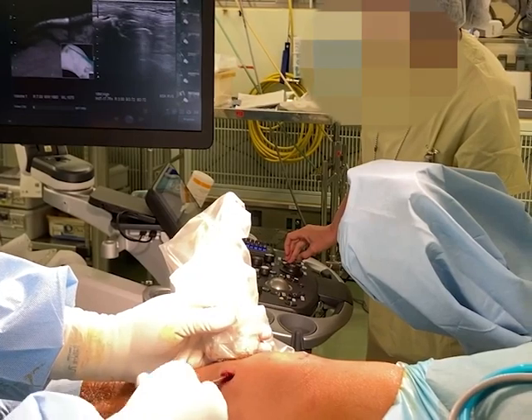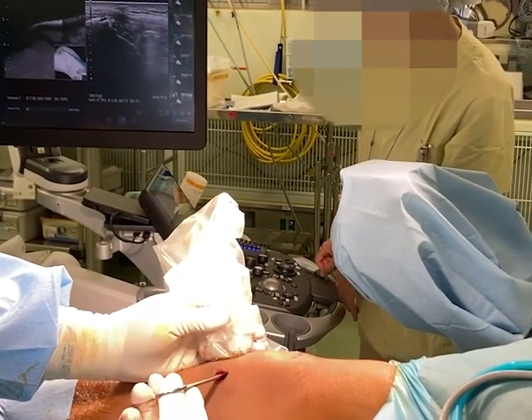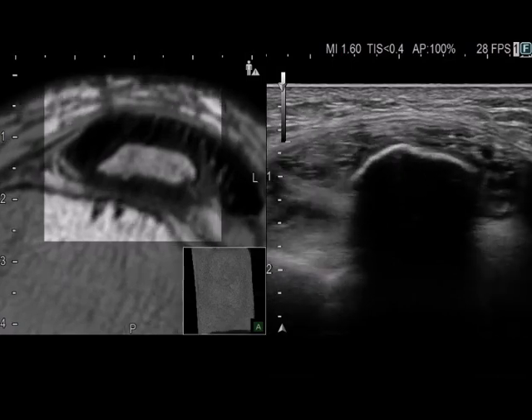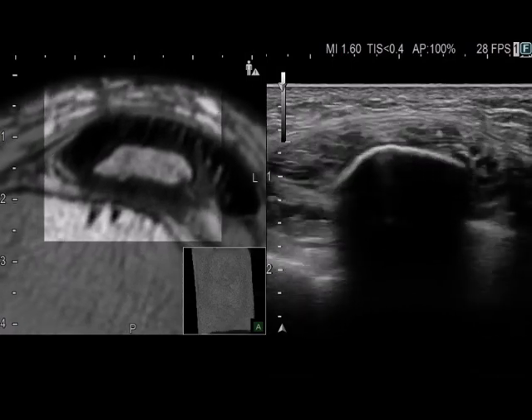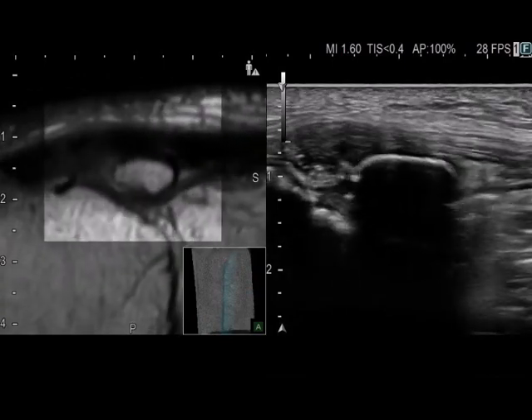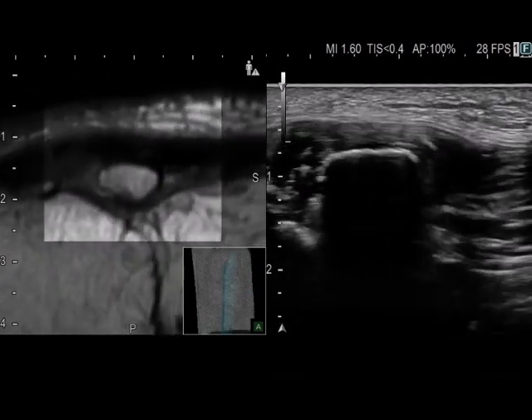The sonographic probe, covered with a sterile sleeve, is placed longitudinally at the level of the tuberosity. From a 1.5 cm longitudinal skin incision at the medial side of the tuberosity, the forceps is inserted to peel the patellar tendon off the posterior side of the ossicle.